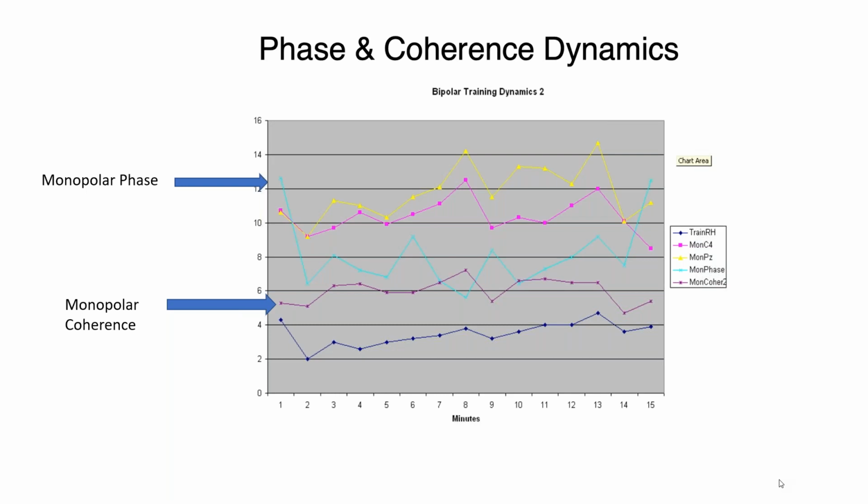My main concern is whether monopolar 2-channel is as effective as what we were doing, because it's much more controllable. You can see the coherence, the phase, and the symmetry live during the training. You can see what's happening. You can really investigate. You can't do that with the bipolar. And it was data that we could record and track on the internet, which we are doing now.